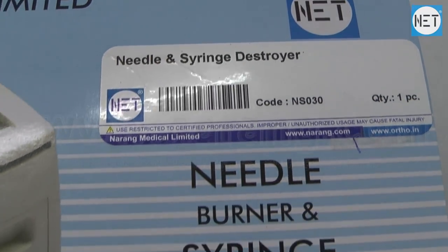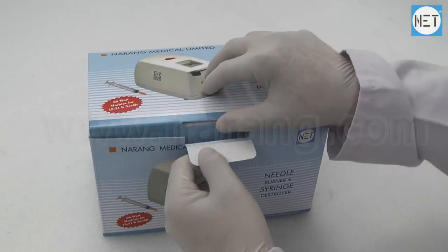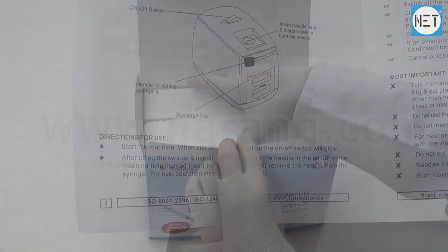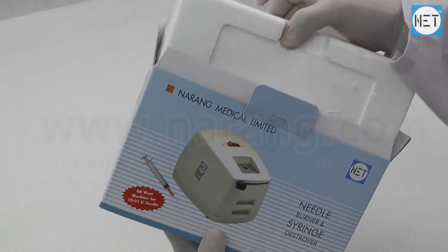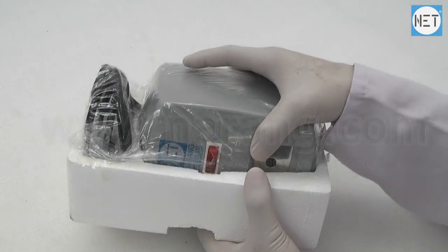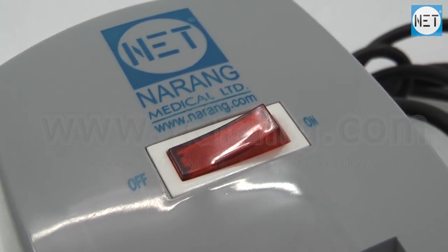Net Brand Needle and Syringe Destroyer. It's an electric device which instantly burns the needle and destroys the syringe. The body of the machine is made of tough, superior, durable and rust proof ABS plastic.